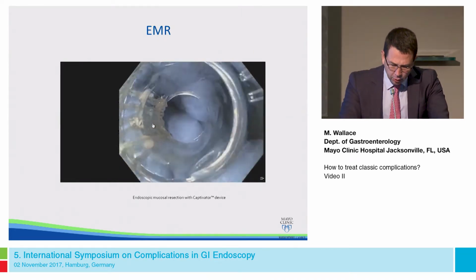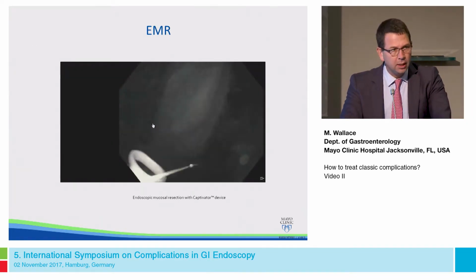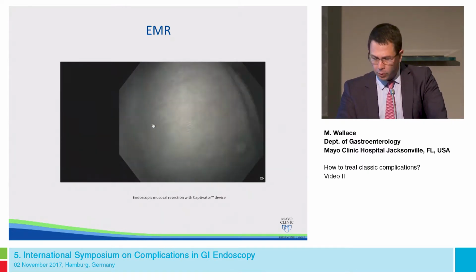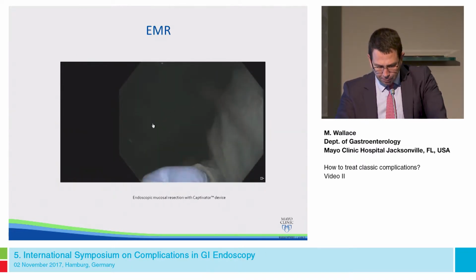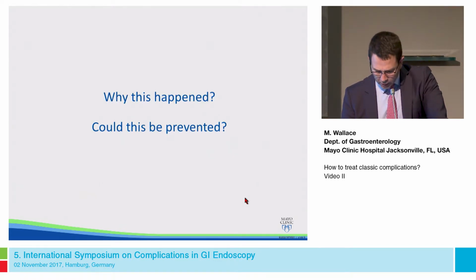So we thought about OTSC, but my concern using OTSC was that we had very little space between the esophageal wall and the pericardium, and I was quite worried, even with the twin grasper, that we would entrap pericardium in the posterior left atrial wall. So we decided to use the zipper method with the TTS, and I'll skip ahead.